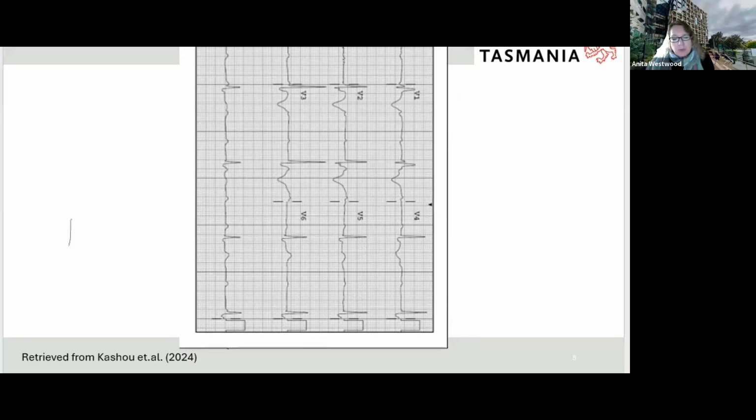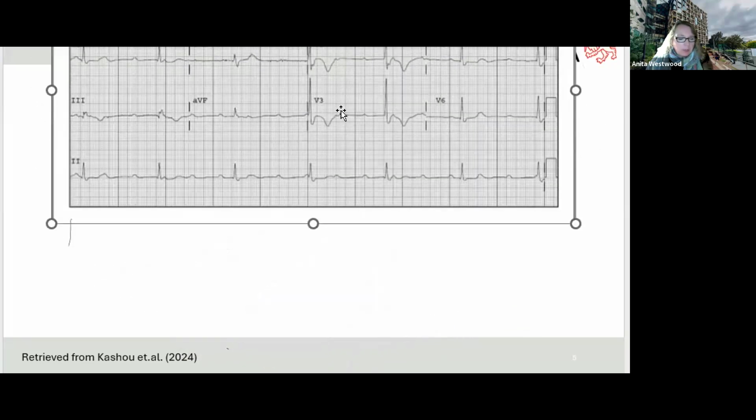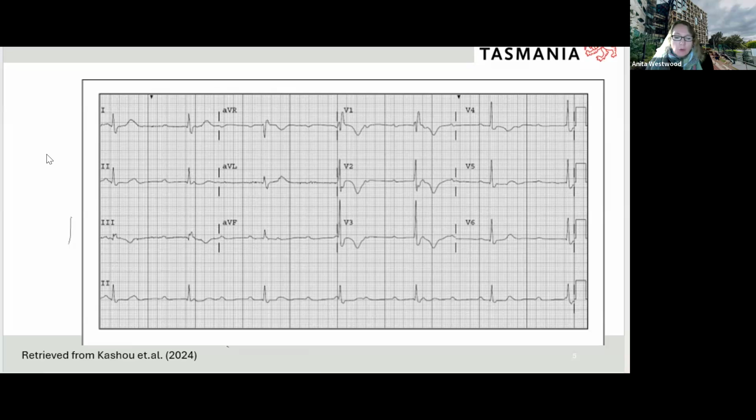There's an easy way to remember it, in a sense, if we look at the polarization of what's happening. Is V1 normally a negative or a positive lead overall? So is V1 a positive lead overall, or is it negative? Normally, in a normal world, is V1 more negative or more positive?